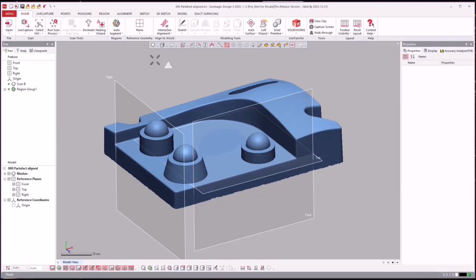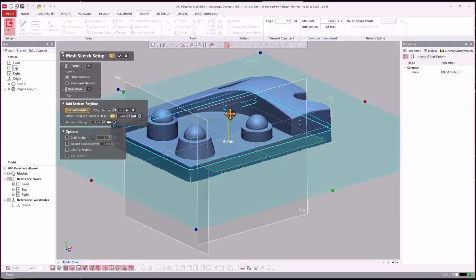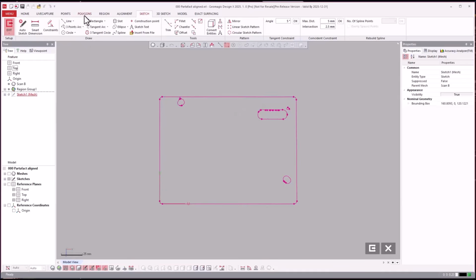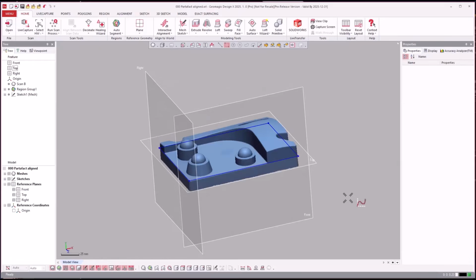But then there's this third one that I have quite a few customers that also do, to where they actually don't model everything in here. They just come in, for example, select this and say, let's do a mesh sketch. They'll come down, and you can even silhouette this. Let's just silhouette the whole part there. And we'll turn our mesh off, and we'll come over to this rectangle tool and check this rectangle tool out. We added this a few years ago, where I can best fit the lines based on a selection of all four sides here, and I can just keep adding to it, you see, and it will fit. And then when I'm done, I can accept it, and we're done. We're out. So now we have the mesh.